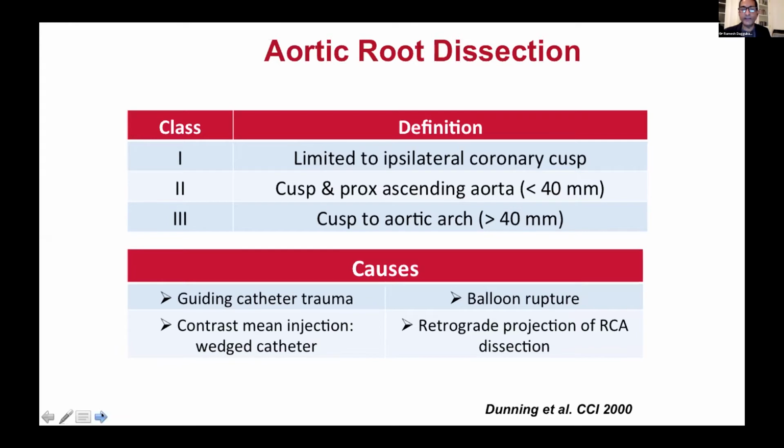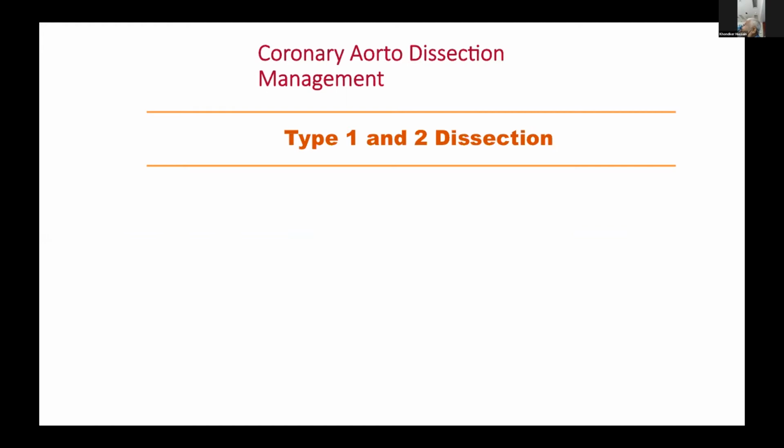In my last case, it was actually an NC balloon after doing a beautiful left main by DK crush stenting. My fellows went up to 18 atmospheres on the left main balloon inflation for proximal optimization technique, sorry, not 18, more than 22. And that resulted in aortic dissection, and I had to put a short stent again to cover that.